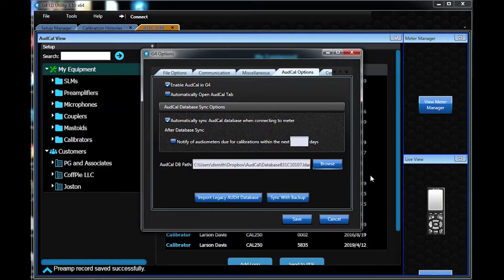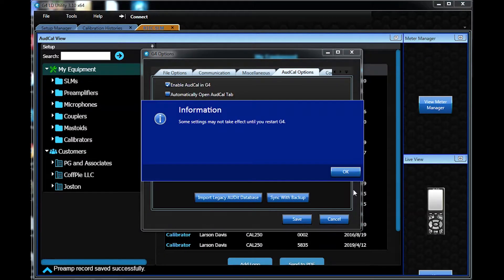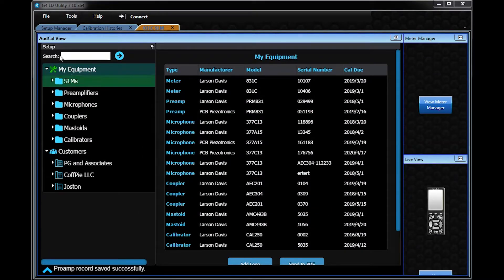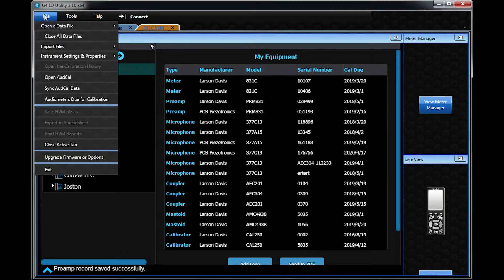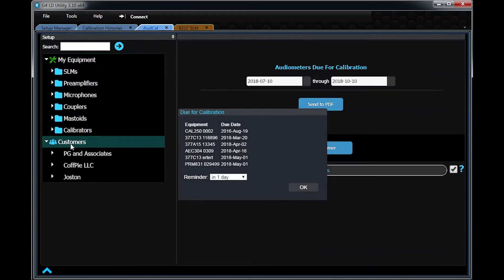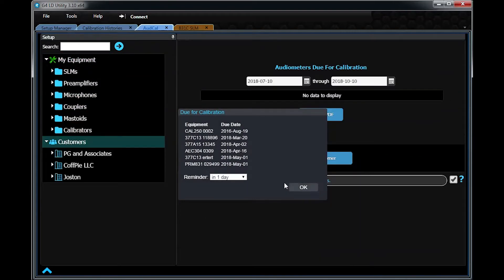The database file can be managed without a meter as well. In G4, go to File and open AudCal. This is your database file. Any changes here when synced to your meter will be in the meter as well.